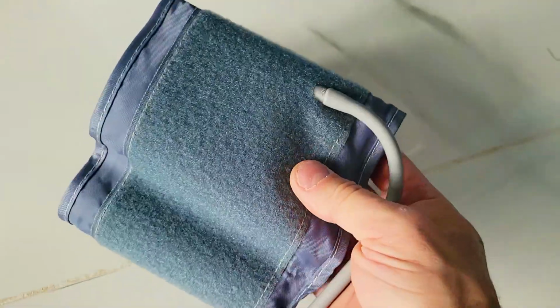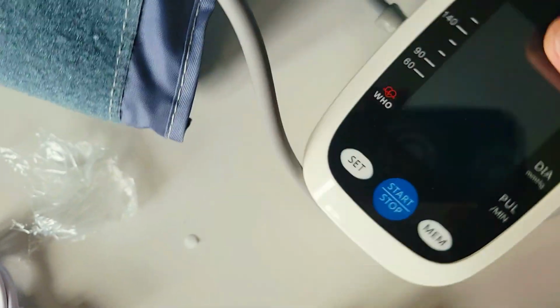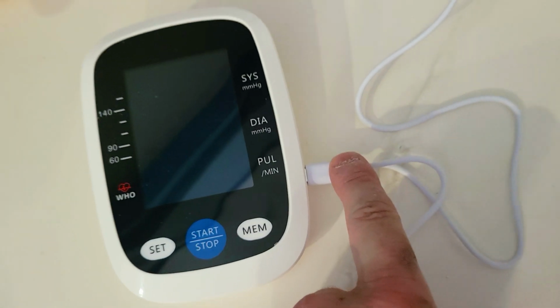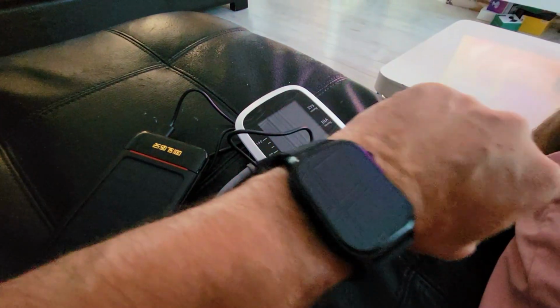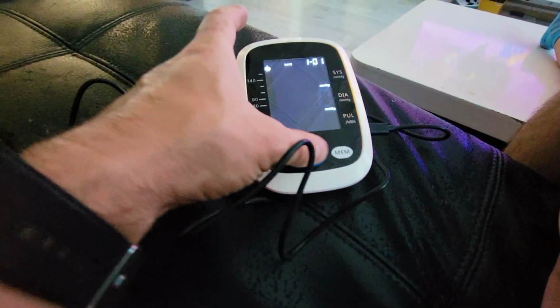All right, so take your cuff and plug this in to the side. There you go. Plug the USB-C cable provided. You want to hook it up right up here over your bicep. Grab this, tighten it up, and then you can always readjust it like so. And we're gonna check this against our watch as well. All right, so when you're ready, just press start.